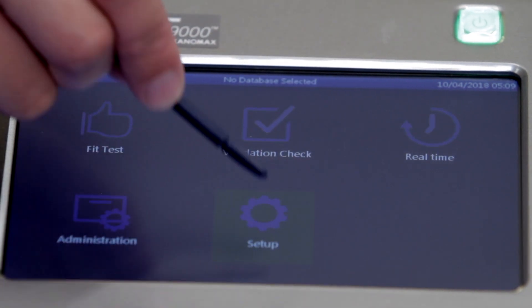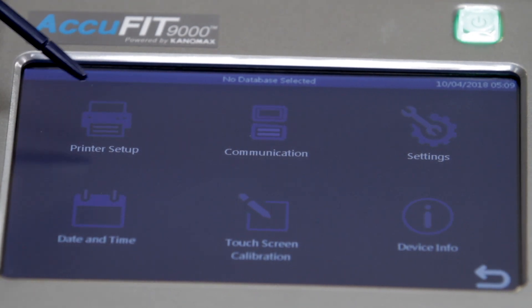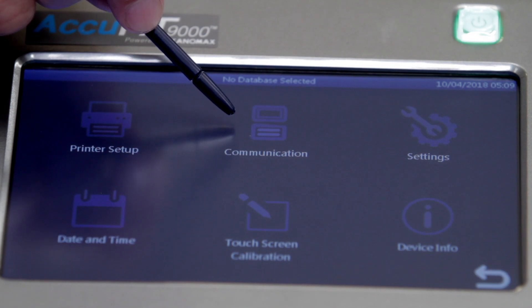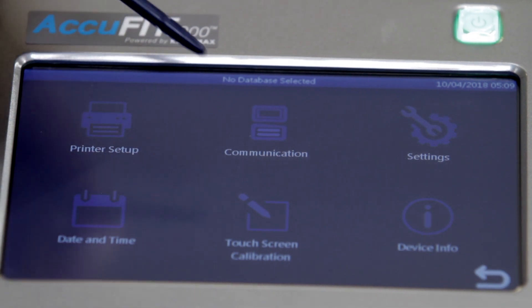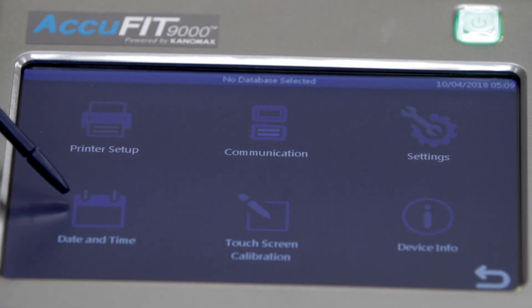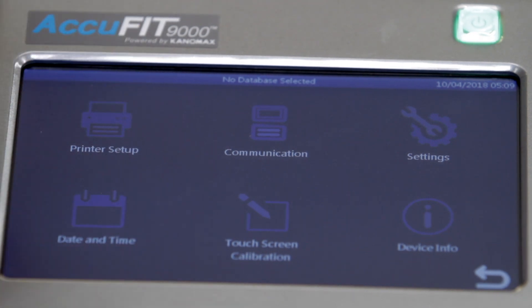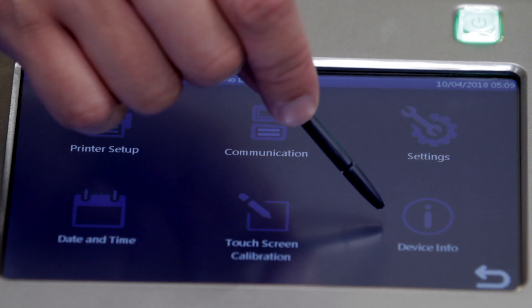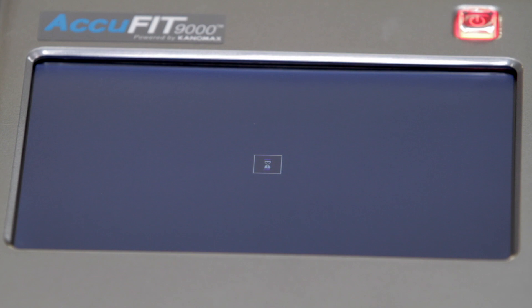Within the setup menu, users can access Printer Setup to configure printer settings, Communication to establish USB, LAN, and Wi-Fi communications, Settings to adjust preferred language, date and time adjustments, touch screen calibration, and Device Info to access information such as serial number and calibration date.